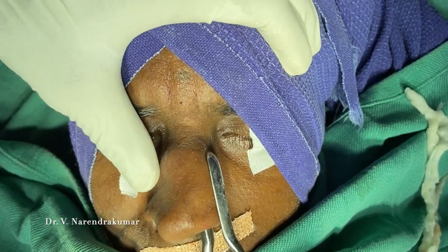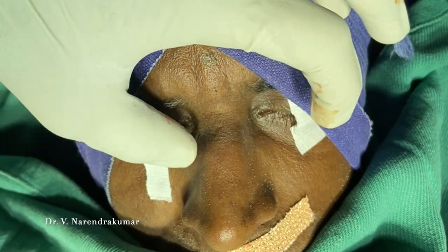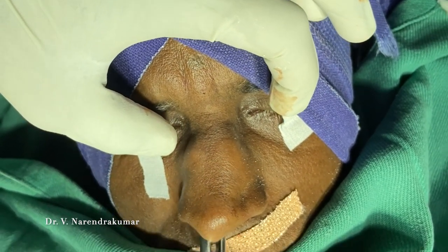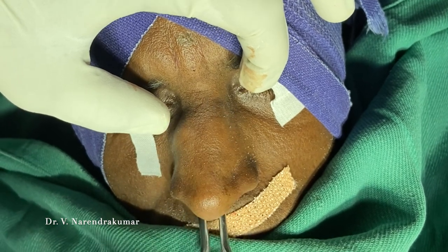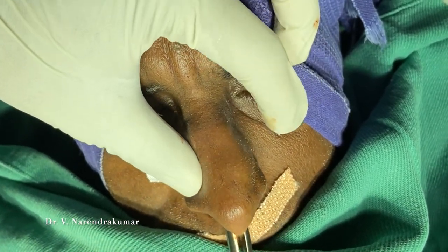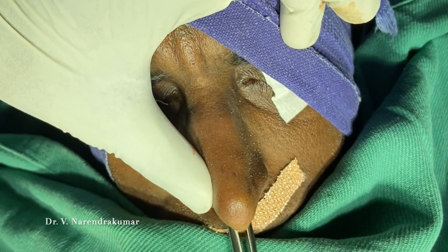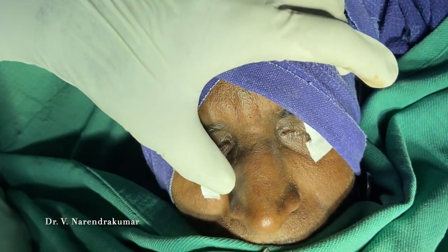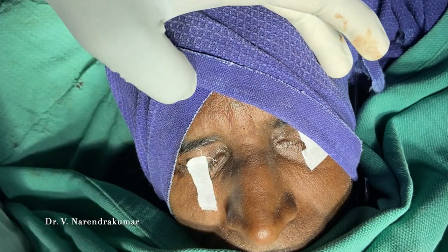After the reduction, we take Asch forceps and insert them in. This is to bring the septum and nasal bones into the midline. Just push it upwards and make sure it is in the midline. It is reduced now.